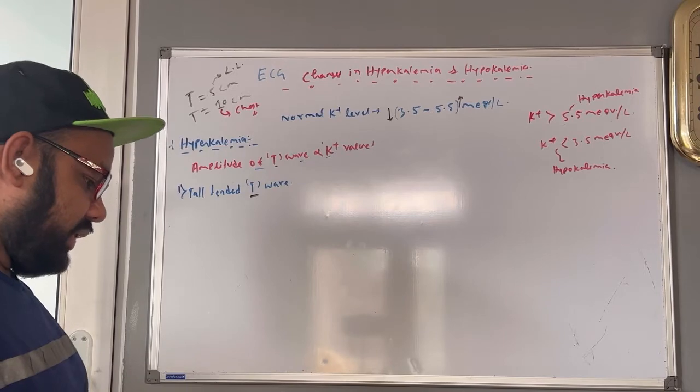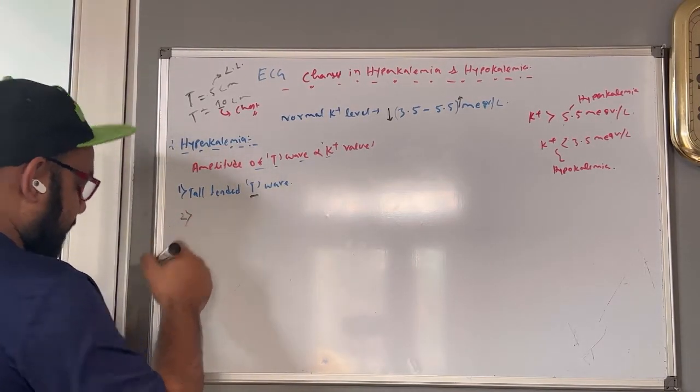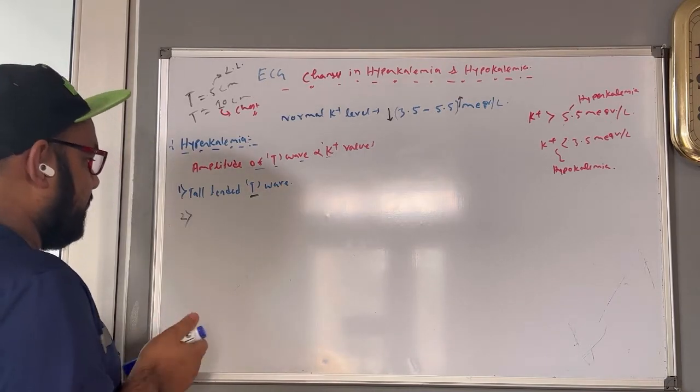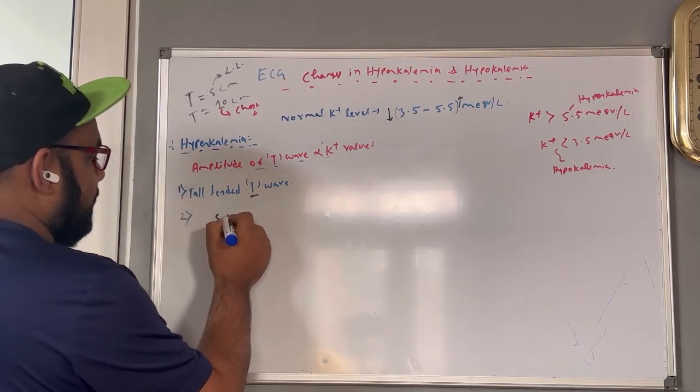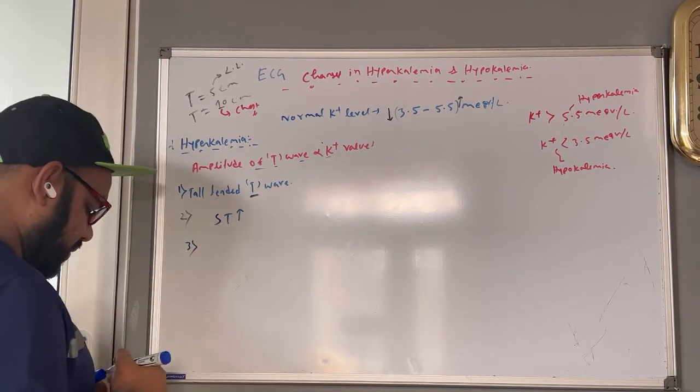Now the next thing, in these cases we'll get the ST segment elevation. We'll get the ST segment elevation. I'll draw the ECG, don't worry. ST segment elevation.